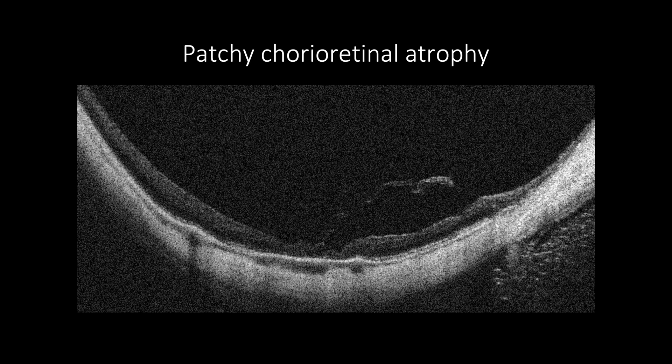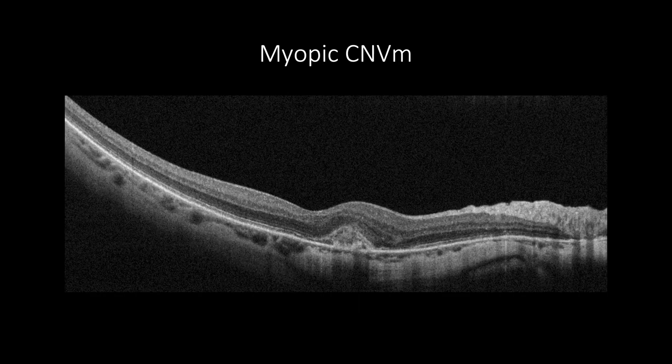In patchy chorio-retinal atrophy, the choroid is absent along with the photoreceptor layer and RPE, and only sclera and inner retinal tissue remain. In myopic choroidal neovascularization, there would be subretinal hyper-reflective material that may have minimal or no signs of exudation, such as subretinal or intraretinal fluids.